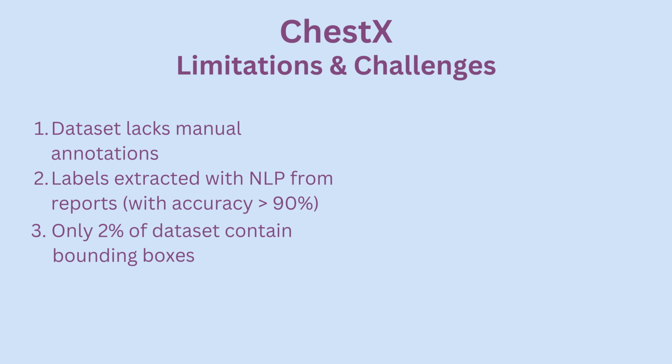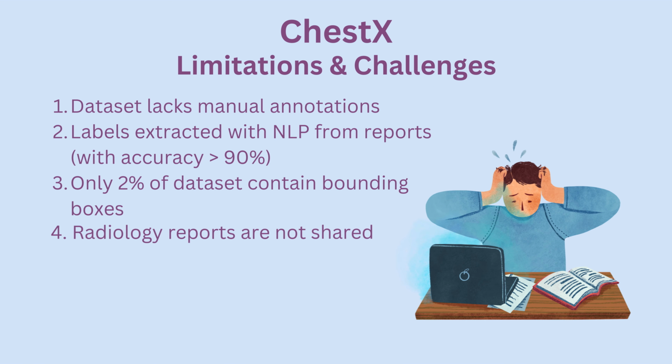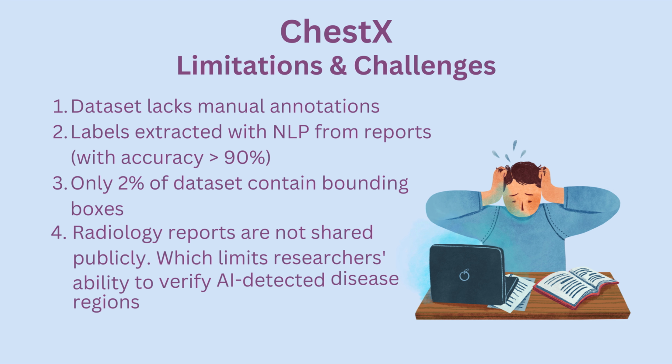Another challenge? Very few disease regions in this dataset come with bounding boxes. This limitation hampers the AI's ability to precisely learn where to focus its attention. Due to privacy and ethical considerations, radiology reports are not shared publicly. While this protects patient confidentiality, it also limits researchers' ability to verify AI-detected disease regions and refine diagnoses.